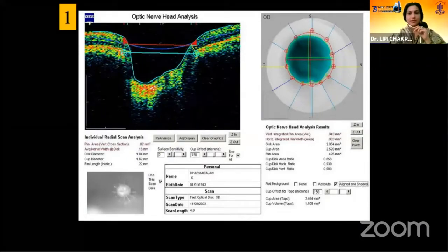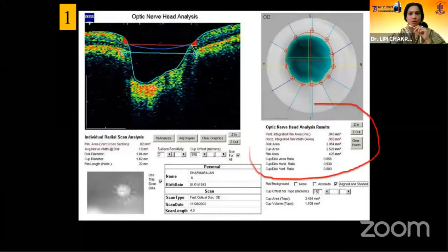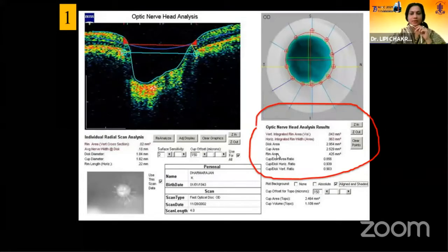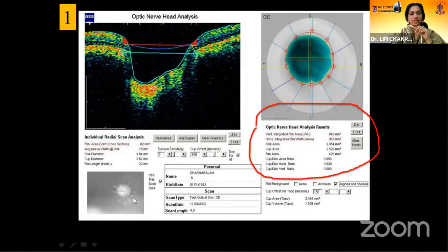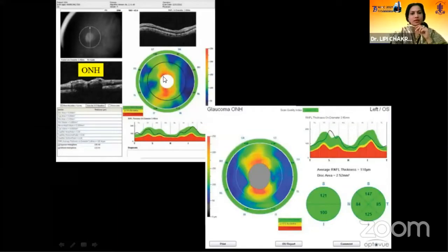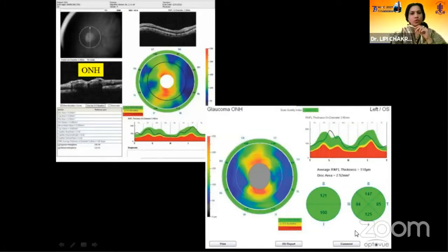This is a classical printout of Zeiss OCT. In this, we can find the optic nerve head analysis results outlined as disc area, cup area, rim area, and CDR. It is 0.85 in this case, which is also reflected in the infrared image — so it's a big cup. The corresponding OptoView RTView picture of ONH analysis is also shown.